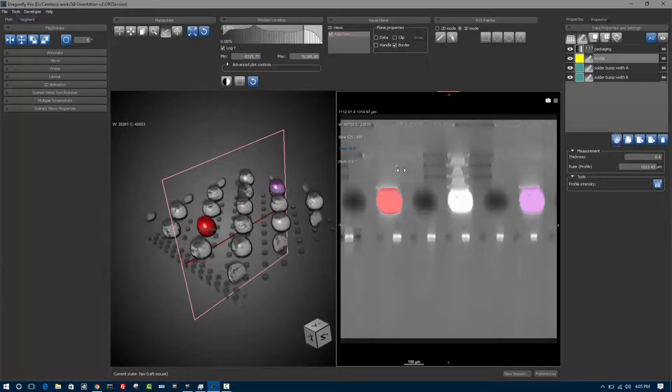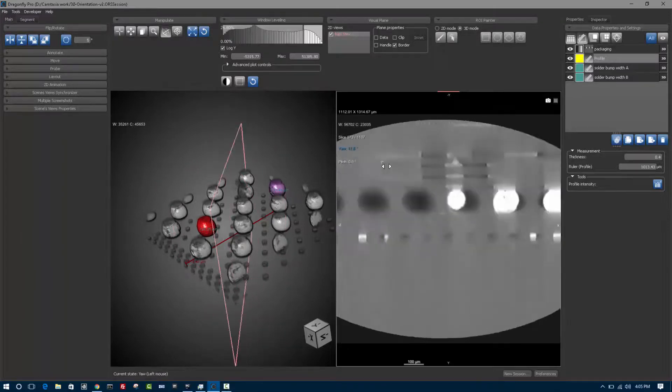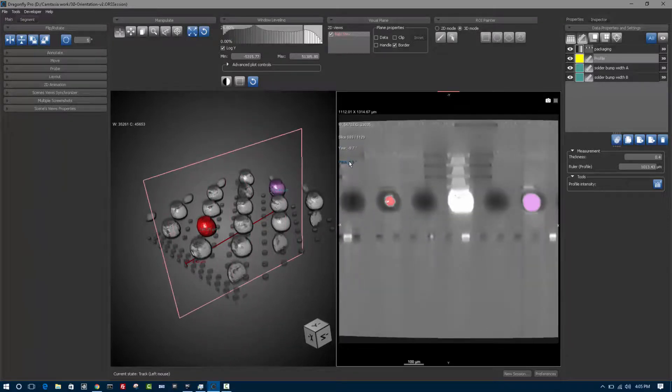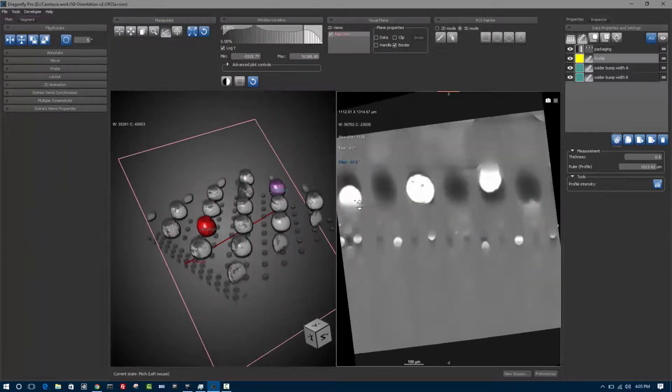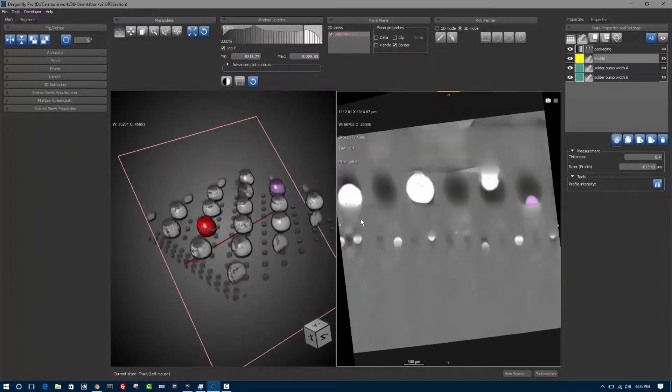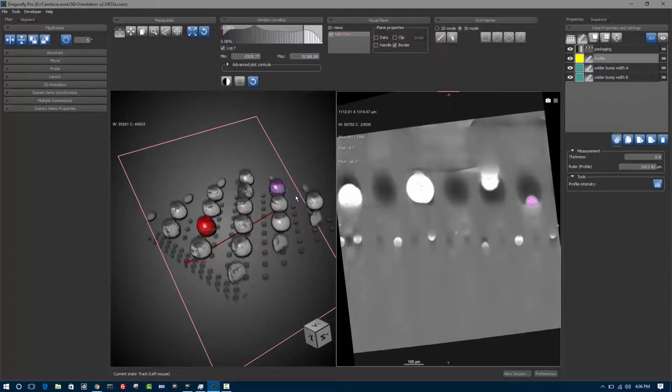Likewise, if I change the yaw or the pitch, you can see exactly what this slice is in the 3D space.